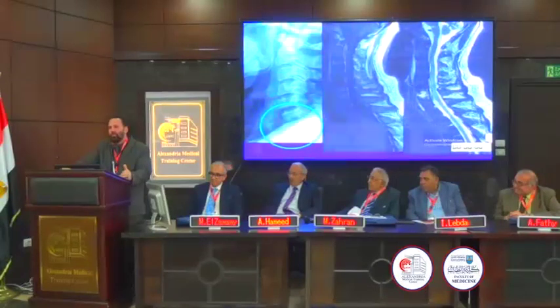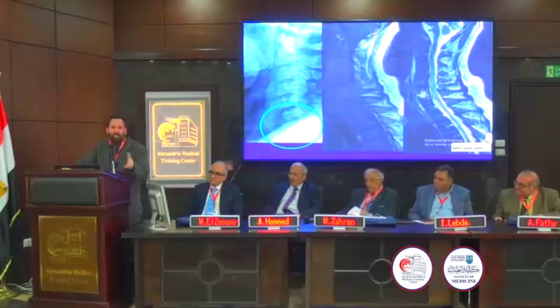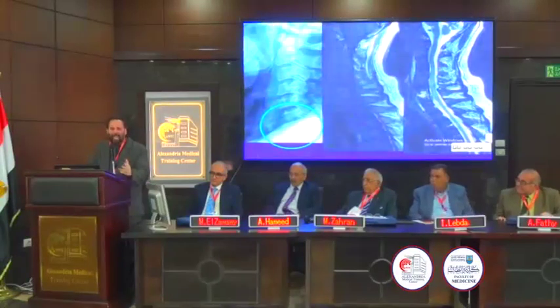Then we tried to distinguish between wet and dry gangrene, with dry gangrene being ischemia much more common, but they both give you these weird bone changes that you shouldn't confuse with osteomyelitis because they rarely have osteomyelitis. Then we went through cellulitis, fasciitis, necrotizing fasciitis: no enhancement, fluid in fascia between muscles, muscle involvement far from skin, and air if you happen to be able to see it.